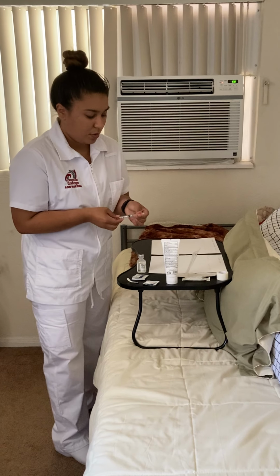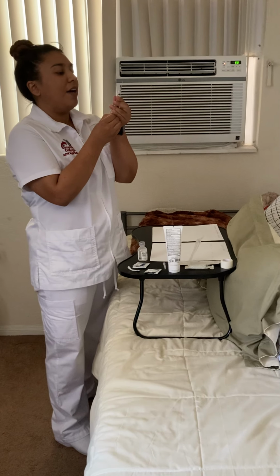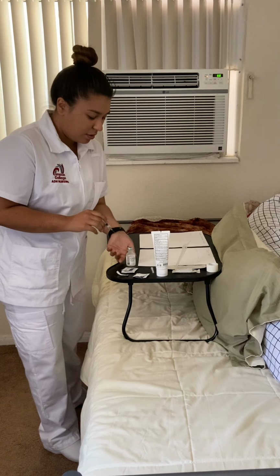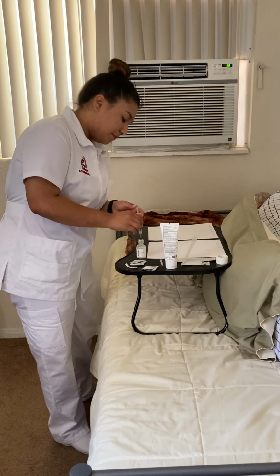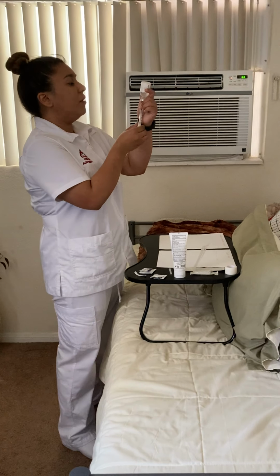So I want to withdraw about 0.5 ml of air, so I don't form a vacuum in the vial. I'm going to go ahead and inject the air and withdraw a little bit over 0.5 ml.